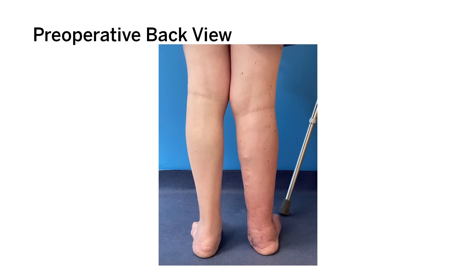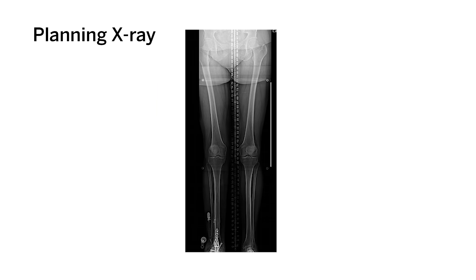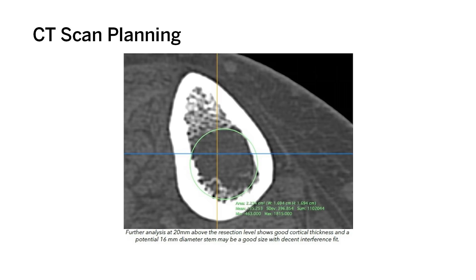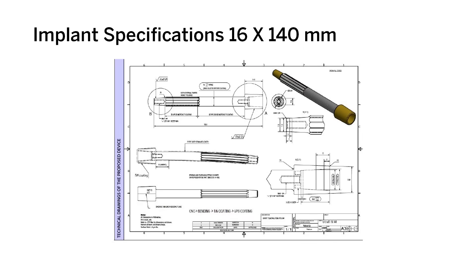Preoperatively, you can see the patient has persistent deformity of the foot with nerve pain and neurogenic symptoms. These are the preoperative x-rays. A CT scan is done to custom plan the size of the implant, both length and diameter. This is what the custom plan looks like going into the OR.